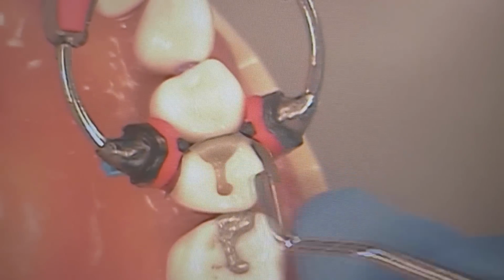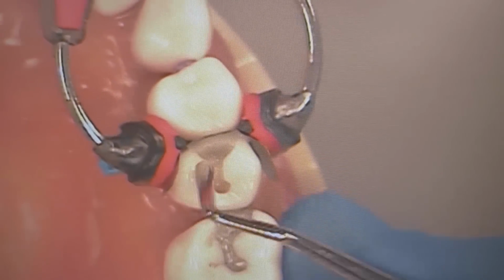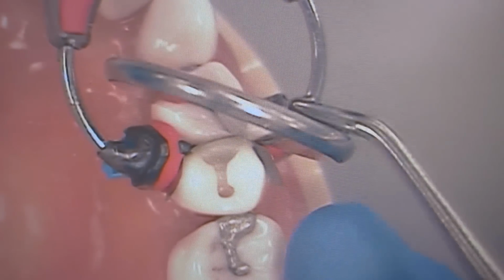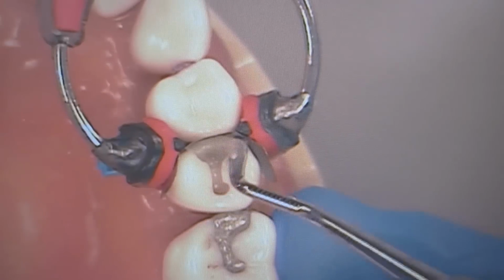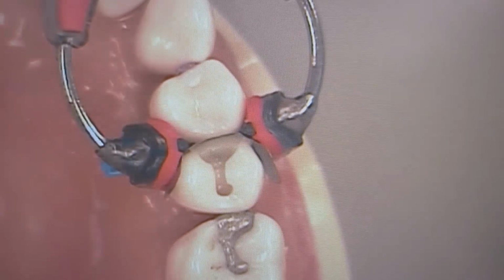Notice how I'm blending it in. So now he's blending it in. You see how that marginal ridge is starting to round out. Are you worried about the excess that's overflowing? Yeah, I'm going to remove that first. Okay, he's going to remove the excess. The marginal ridge looks nice there, right? Yeah, marginal ridge looks good. It looks like a tooth. Smoothing out with the paddle. Marginal ridge height looks about right.